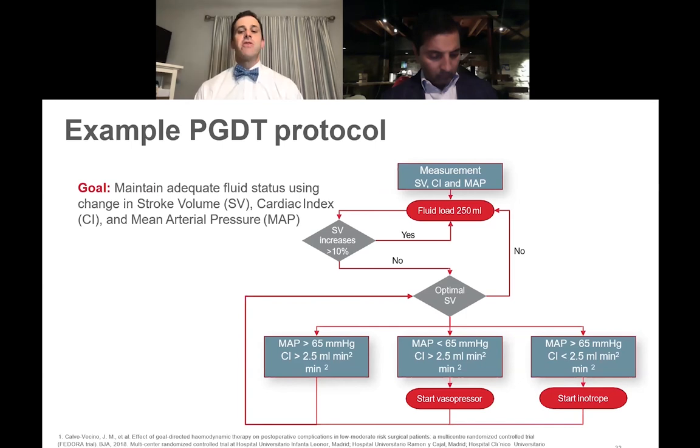And it's designed initially for patients with a minimally invasive monitor in place, but we can use this with the Swan as well, and occasionally we will use it there, depending on the patient. So we use this goal-directed approach just to continually assess and reassess the patient until they are stable. Next slide.